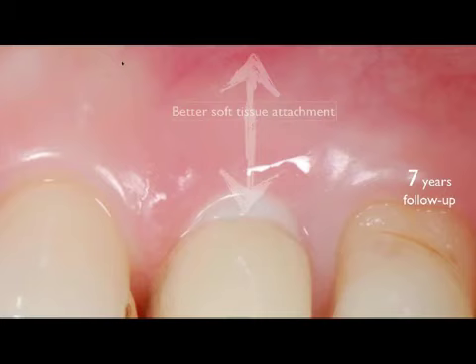And as a result of all this, our soft tissue attachment rivals that of teeth. Now, I'm not saying that there is connective tissue attachment to the actual surface of the zirconia, but there are no probing depths with these implants. The probing is very minimal. It's the attachment that is extremely similar to natural teeth, and it's evidenced by the healthy soft tissue that we almost always see around these implants.